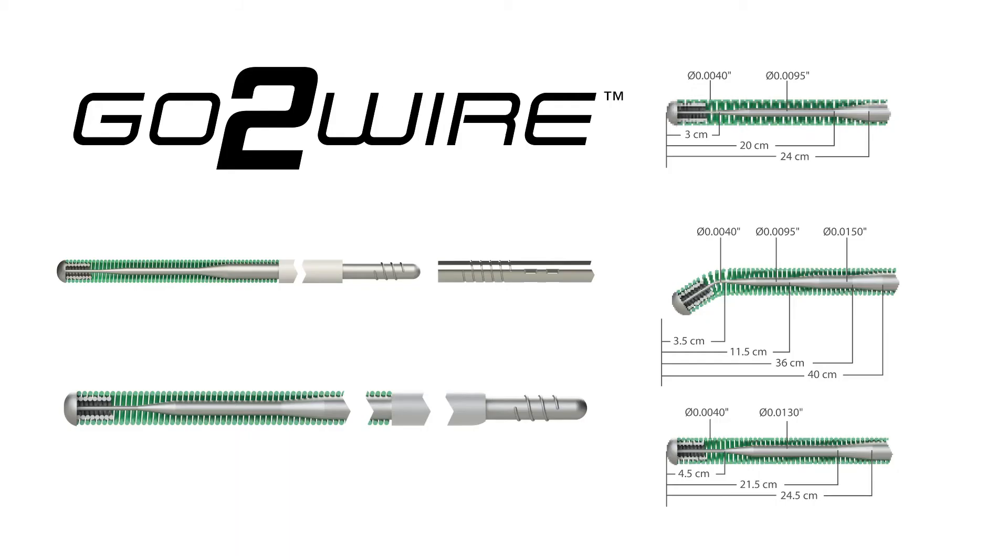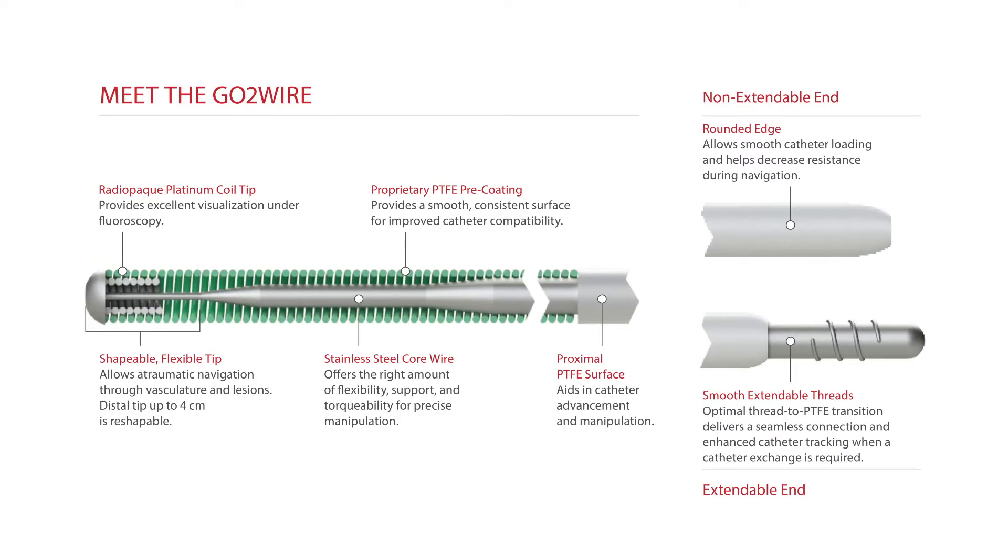Hi, I'm Dr. Bruce Graham, and this is a step-by-step instructional guide to the GoToWire system. The GoToWire system is a versatile .35 steerable guide wire with improved exchange capabilities, advanced tip response, more length options, and patented PTFE pre-coating, making it the new GoToWire for diagnostic and interventional procedures.